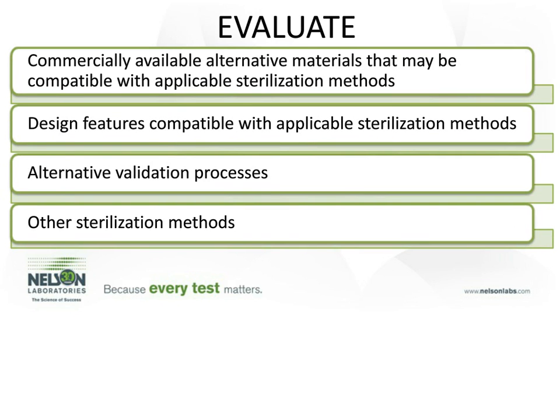Now, one thing that we are adding to this document is some things that you need to evaluate when you are looking at the risk. And in this case, commercially available alternative materials that may be compatible with applicable sterilization methods.